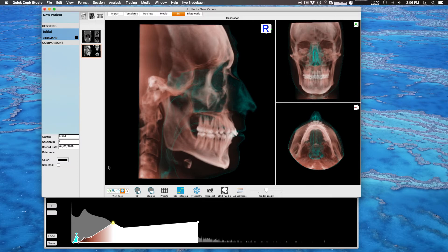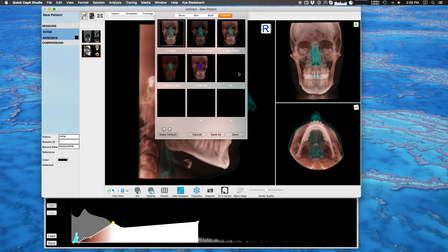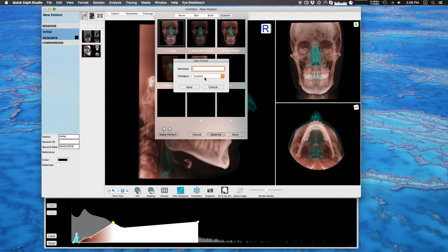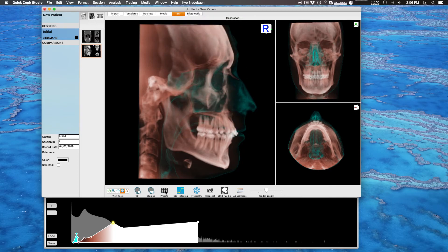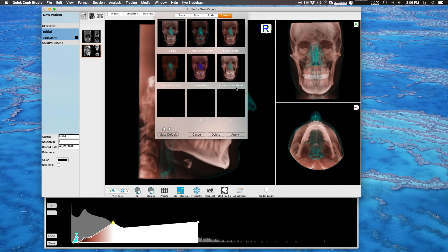Once you have a preset that you like, you can save it. When I choose save, I go to custom and save it as a new one. I'm going to name this our demo color preset, and it's going to go in the custom category. Now you can see if I go to presets and go to custom, I have my demo custom preset. If you like this preset, you can also make it the default — when you load a new DICOM in a new patient file it'll automatically apply this default rather than asking you, though it doesn't stop you from choosing something else.